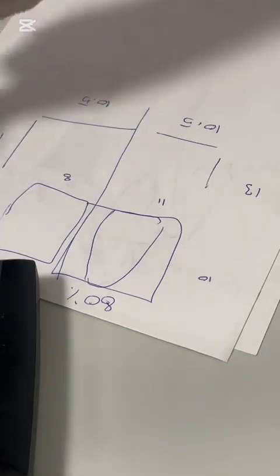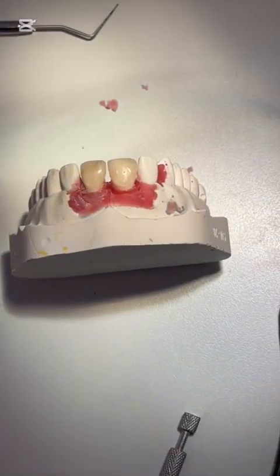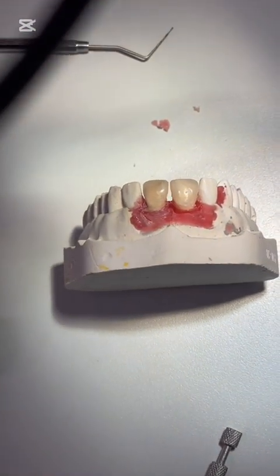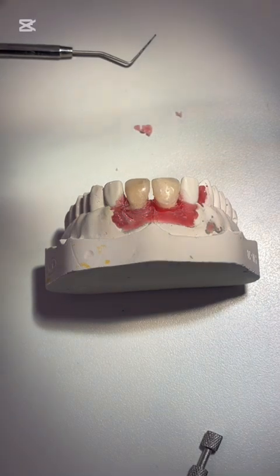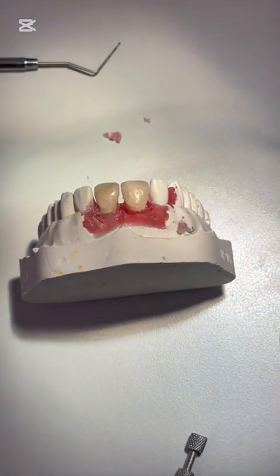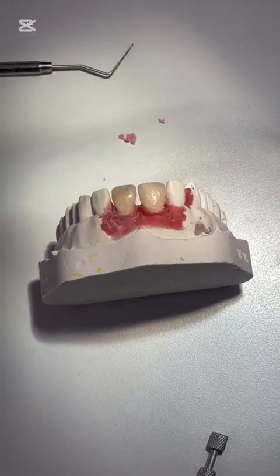How can I achieve that? We can first take an impression and send it to the lab. The lab will make the mock-up from wax and send it back to you. You will take an impression, the silicone index, and work on the patient's mouth. Or you can do it freehand because the patient has no time and you will do it now. So you can do it with composites roughly, take the impression, then do the permanent composite. Okay, understood? Now we will do it roughly.